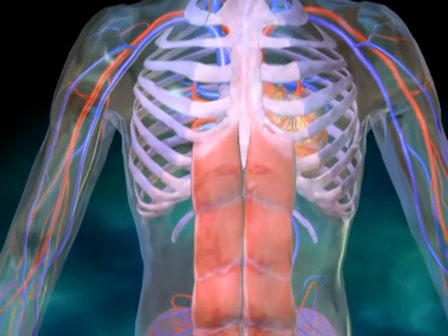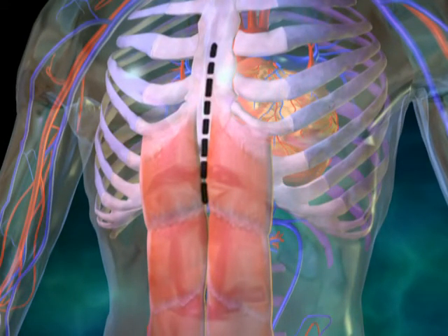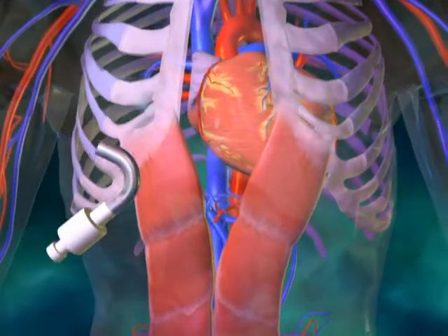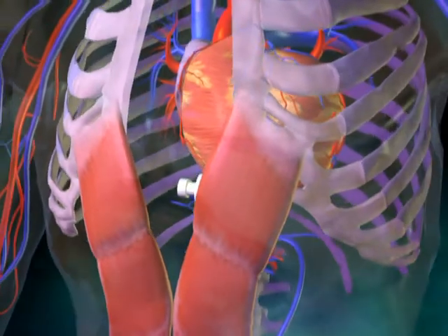In order to implant the HeartAssist V VAD, a median sternotomy is performed and extended to approximately 5 cm below the xyphoid process. If needed, a pocket should be formed within the rectus sheath beneath the rectus muscle using the pump sizer for size determination.